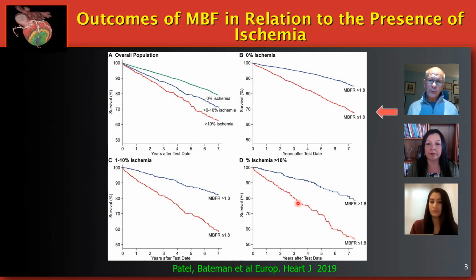There are some software packages, particularly in the single compartment model, that will give you a blood flow. They will calculate it on the basis of the heart rate blood pressure product times 1,000 and come out with a number. My problem with that is I've tried to do that and it doesn't always work. So I think the proper response is to identify that there's an issue with the rest data. And you may, in fact, need to repeat that resting study because there's something wrong.